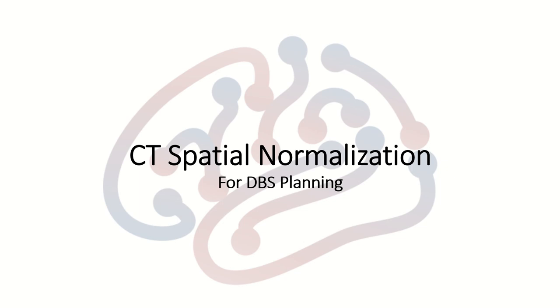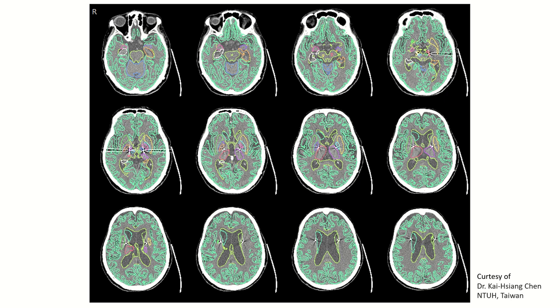In this video I'm going to show how to work out CT spatial normalization for DBS planning. Here we normalize the CT image to a standard space so that we can bring in subcortical regions and nuclei. Especially for DBS planning, this will help us to know where the electrodes are located.